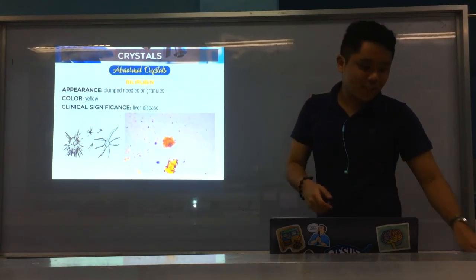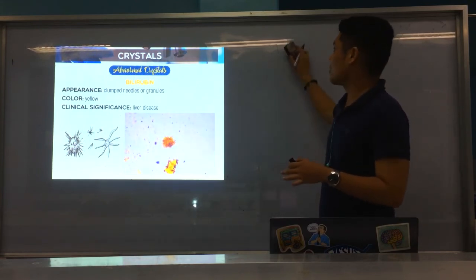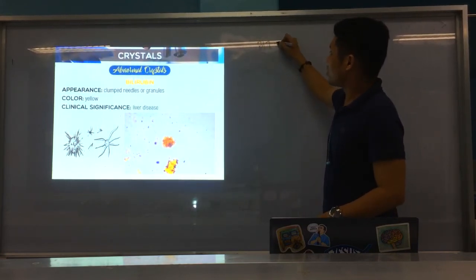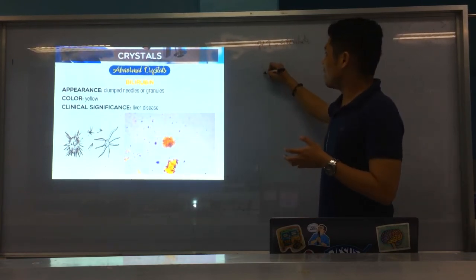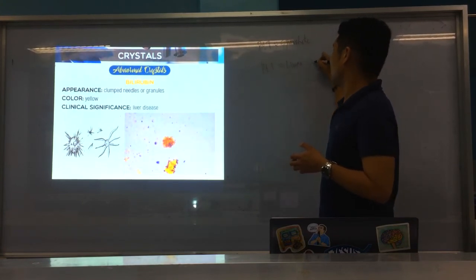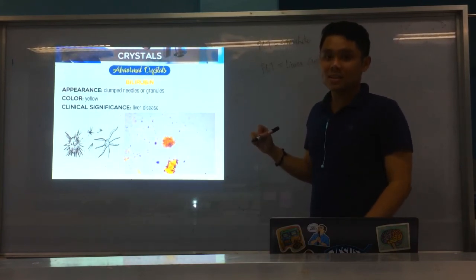So, I know I've introduced this mnemonic in Intro to Micro, di ba? Okay, so, BLT for micro, these are your spirochetes, di ba? You have Borrelia, Leptospira, and Treponema. For CM, BLT is the liver disease crystals. Okay? So, ang meaning sa BLT, bilirubin, leucine, and tyrosine. So, silang tulo ang mga liver disease crystals.